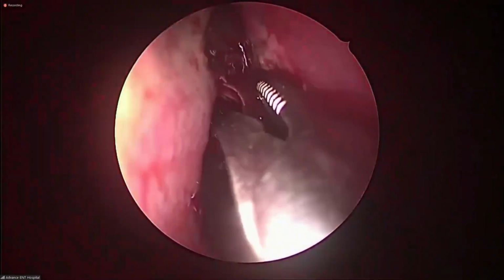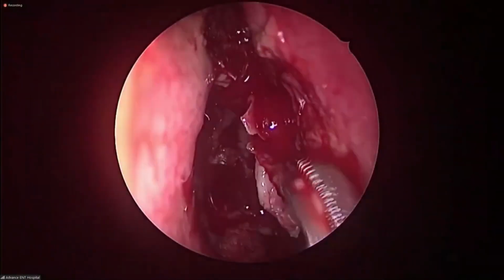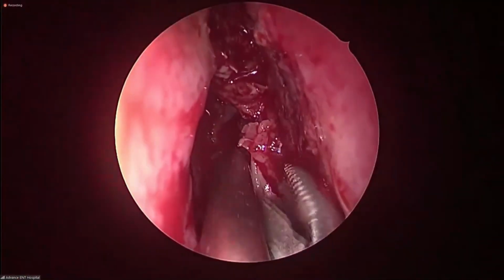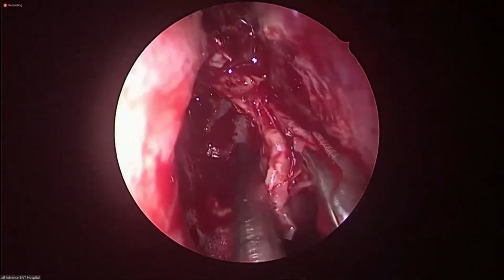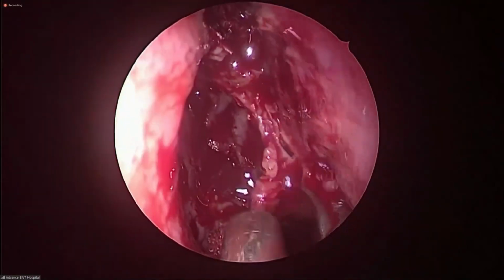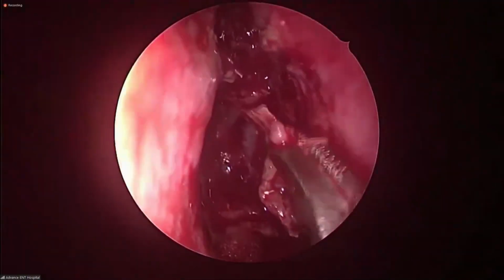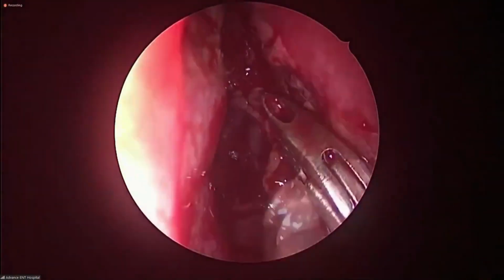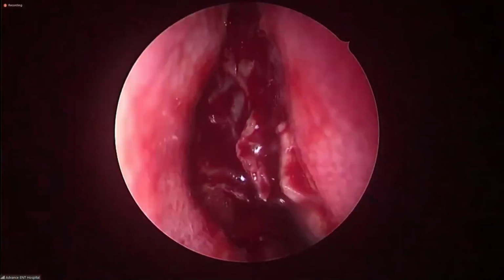So what I will do first, as usual, as I said, is the turbinate. Resecting it, a partial resection. Give me the brighter light.